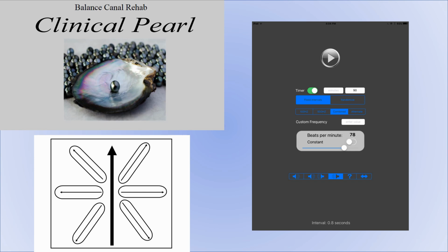Okay, this application shows you how to do semicircular canal pair rehabilitation. Quick refresher, the left posterior canal and the right anterior canal are linked in a push-pull fashion. Likewise, the right posterior canal and the left anterior canal work in a push-pull fashion. If you refer to our first video on Tone Pacer, it goes into great detail about 500 hertz being related to the posterior canal and 100 hertz being related to the anterior canal.